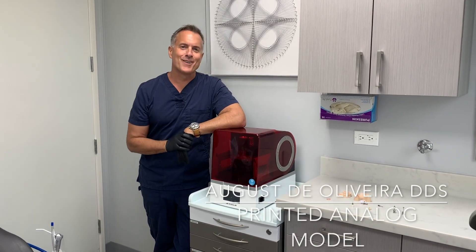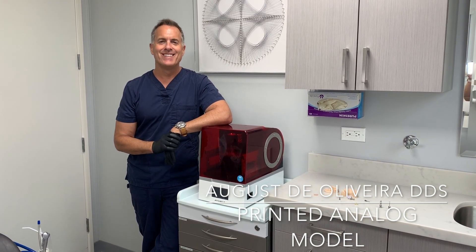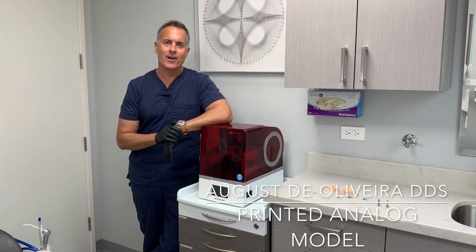Hello everyone, I'm Dr. August de Oliveira, and I'm here to talk about the exciting world of 3D printed digital analog models. We're all familiar with conventional stone implant analog models.